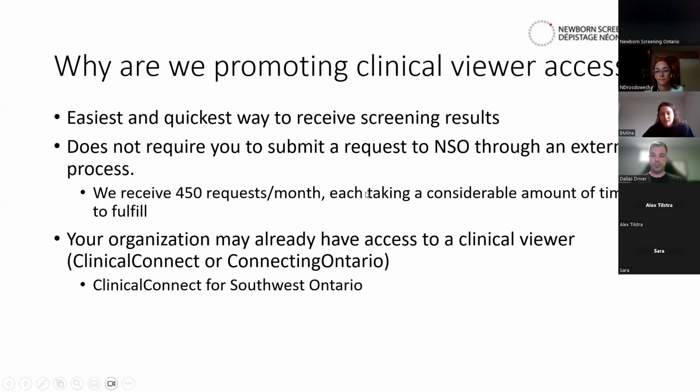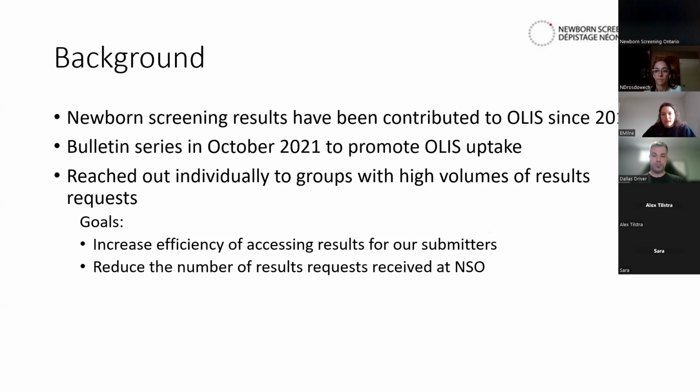Your organization may already have access to a clinical viewer such as Clinical Connect or Connecting Ontario. Clinical Connect is for those submitters in Southwest Ontario and is managed by Hamilton Health Sciences. And accessing a clinical viewer does not cost any money. As mentioned, newborn screening results have been contributed to OLIS since 2015.